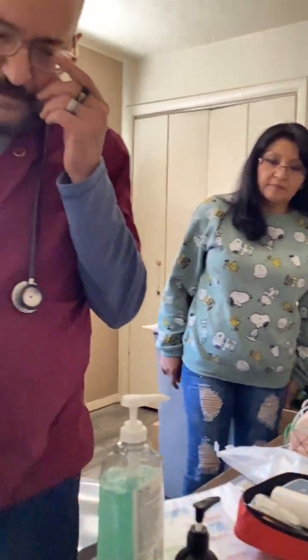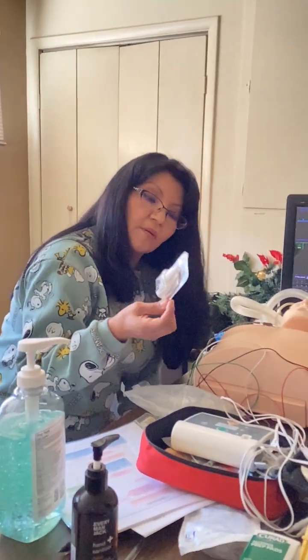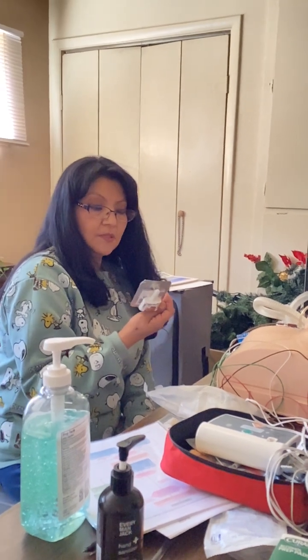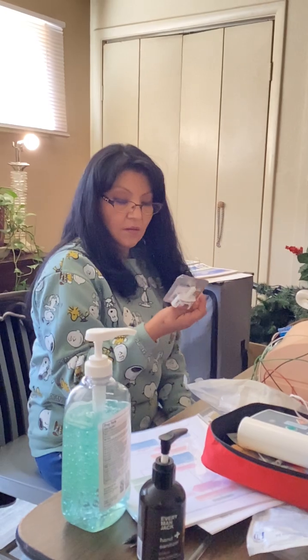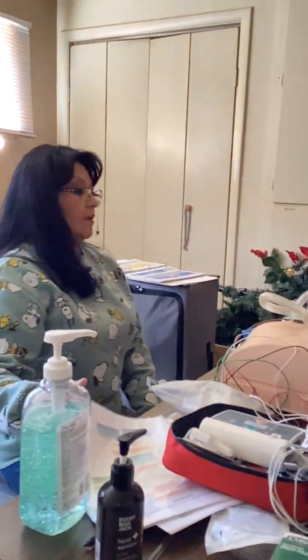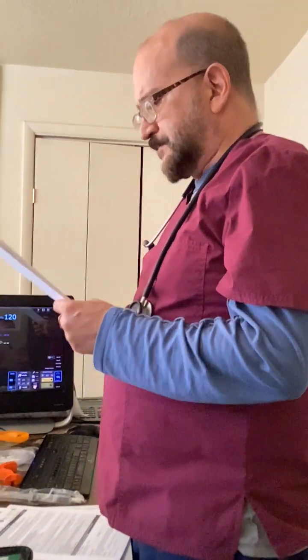So let me give you a scenario. It's intranasal Narcan. This is prescription, you have to have, oh, it's prescription only? No, a lot of it's over the counter now. Okay. So give me a second. This is gonna be a child with AED.